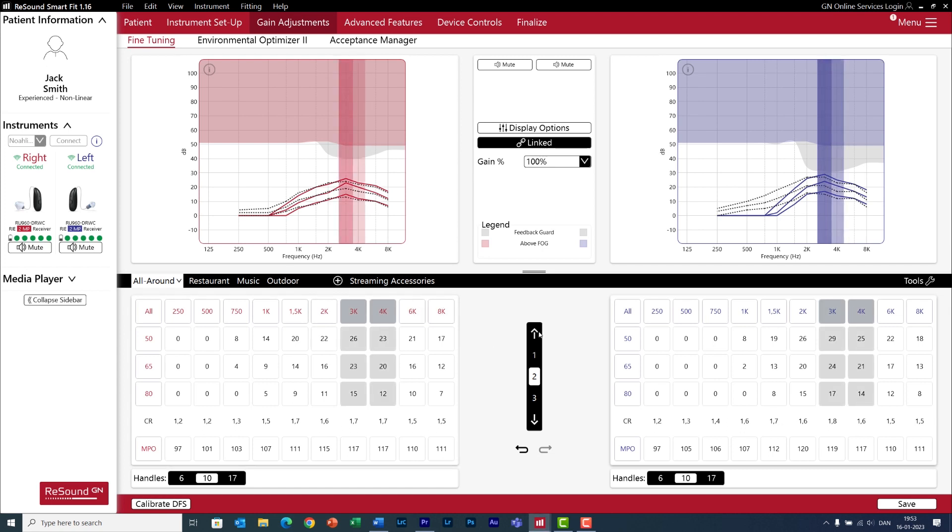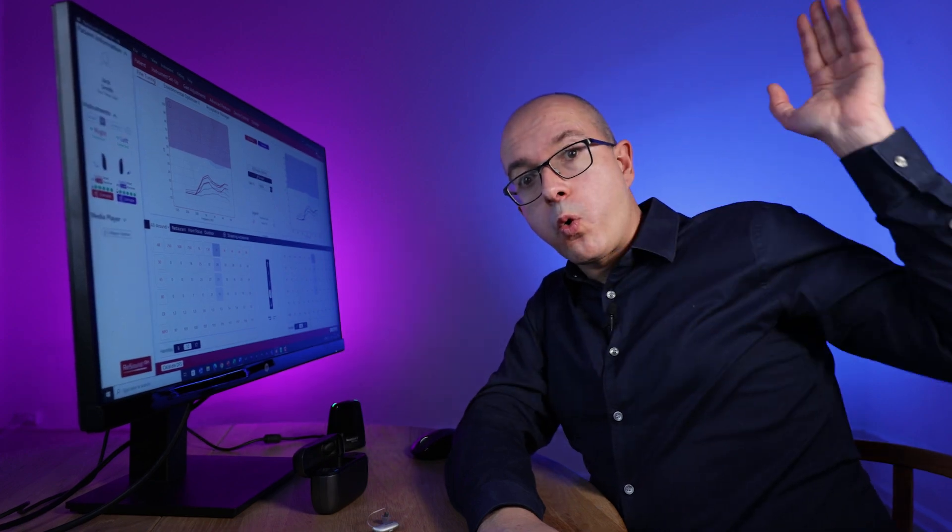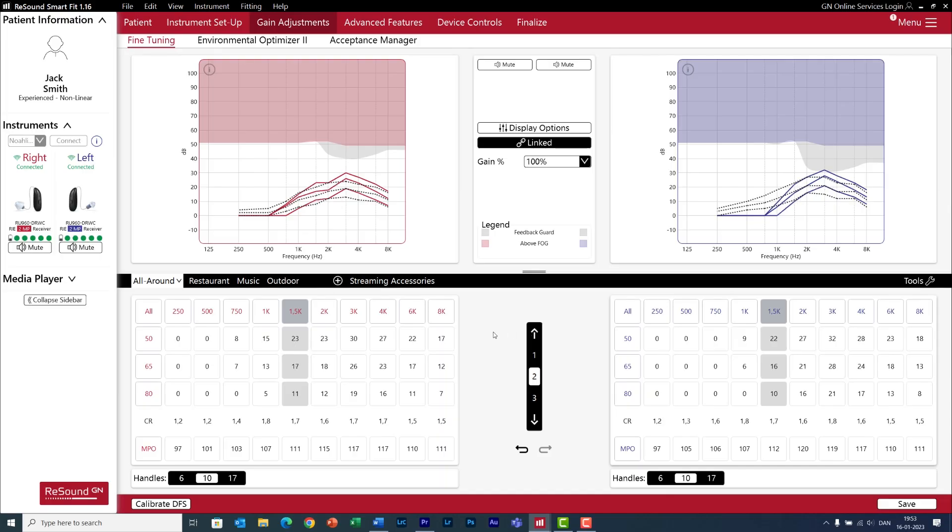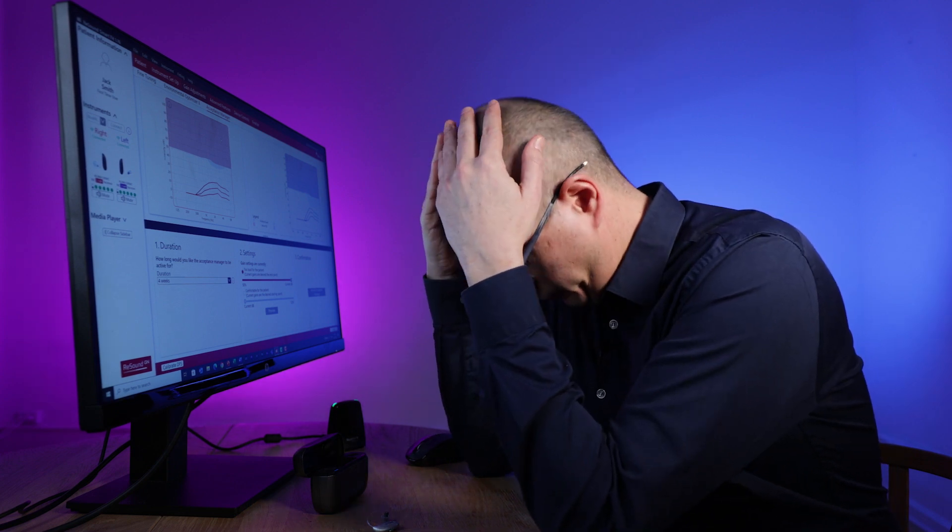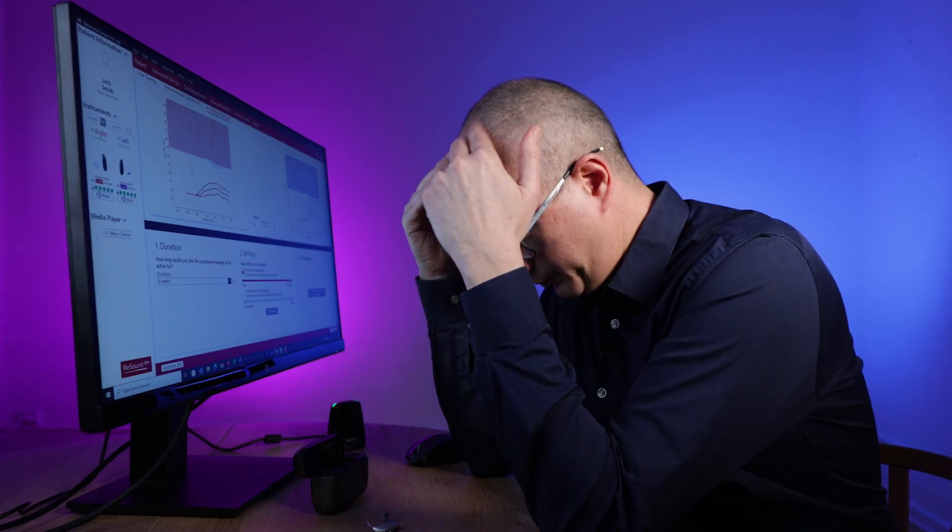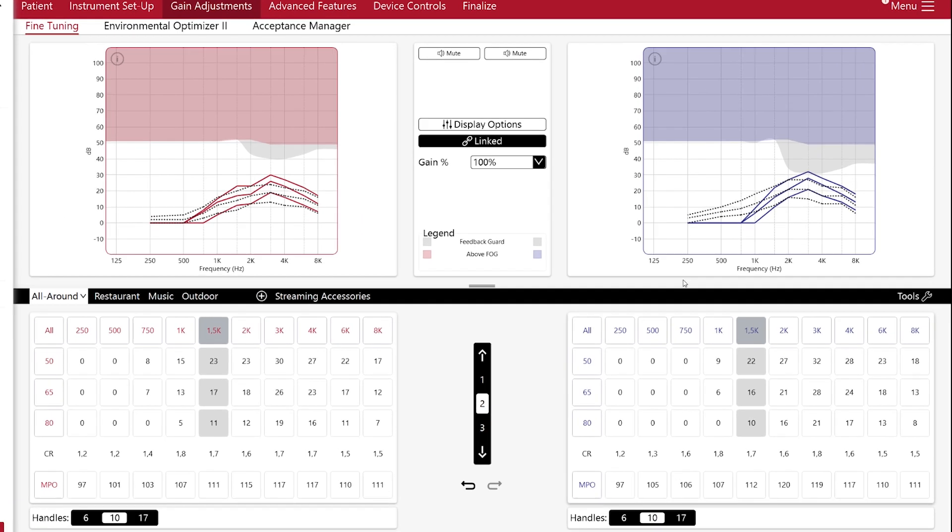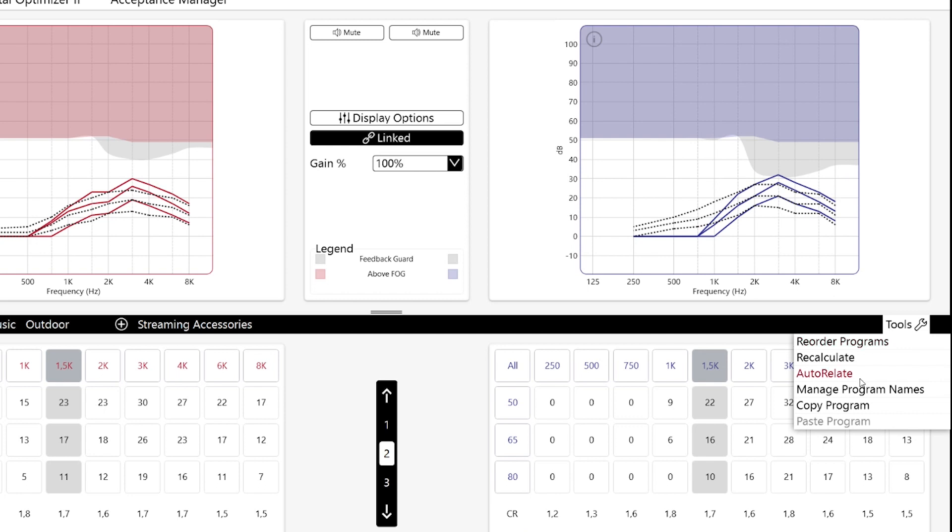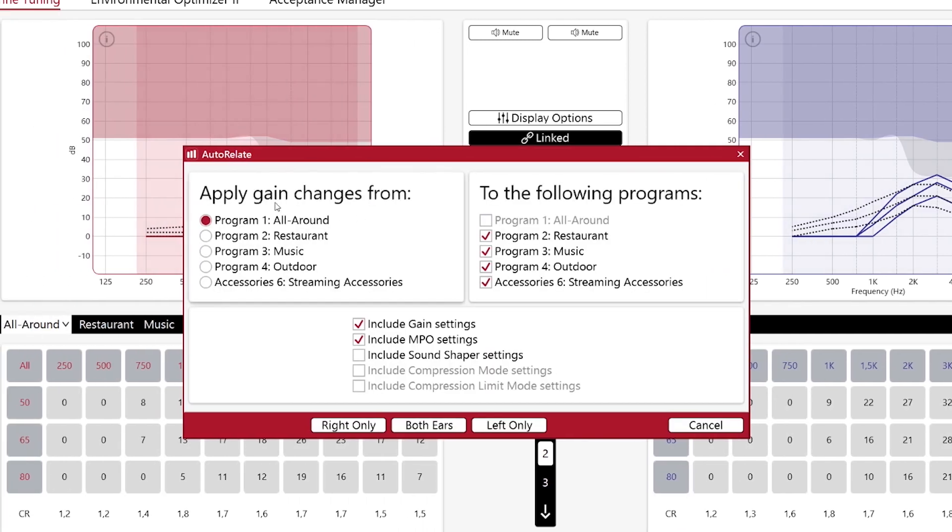This feature has saved my life so many times. You know how sometimes you work with difficult clients who are never satisfied with the sound quality of the hearing aids, and you spend hours doing fine tuning without success until finally your client says, that's it! I love it! Great, but that was only one program. Do you have to go through the same nightmare for the rest of the programs? No, my dear Padawans, because you can use Autorelate. Go to Tools, Autorelate, and now you can copy all the fine-tuning changes from your program to any program you want.